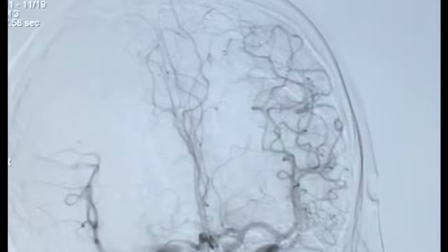And this is the AP view, again showing the same picture of a Caroticocavernous Fistula, direct type A Caroticocavernous Fistula. This is important when we are doing the angiogram of the carotid artery on the left, and we see that through the anterior communicating artery, the blood is coming down into the fistula, and the fistula is filling even from the left carotid injection.